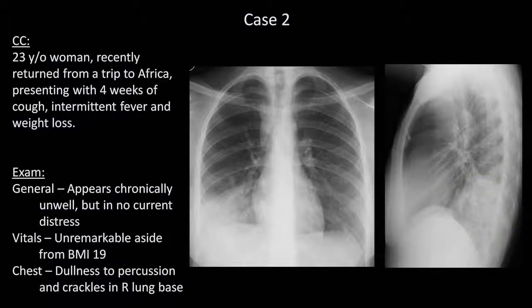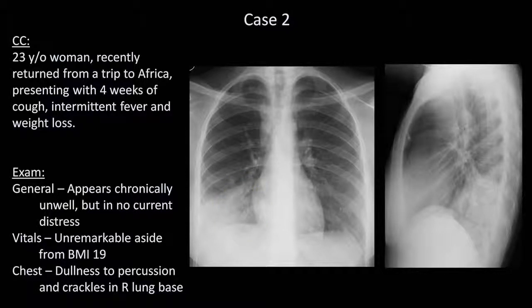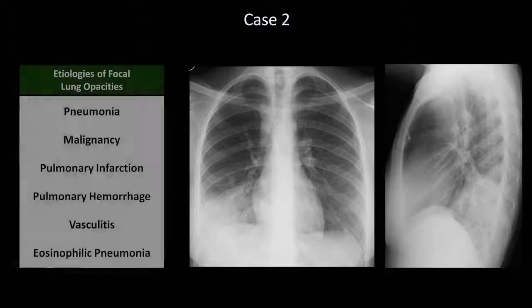This is a great example of the spine sign, in which there is an interruption in the normal progression to increasing lucency as one moves inferiorly down the spine on the lateral film. In addition, this opacity is well-defined and dense enough to be referred to as a consolidation. On the PA film, if you examine this area more closely, I think you may be able to make out an air bronchogram. What is the etiology of this focal lung opacity? Let's take a look at the etiologies of focal lung opacities from Lesson 8.